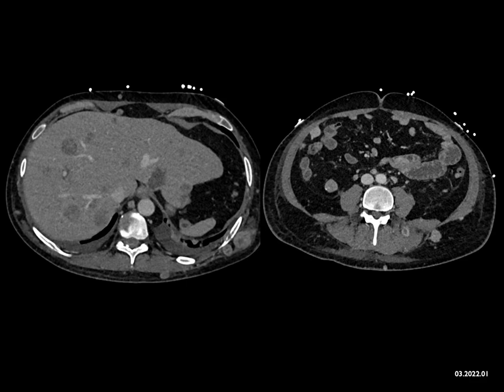The things I think about the most are lymphoma and melanoma. Neuroendocrine tumors can metastasize to multiple areas — not quite as extensive, but typically they're going to be hypervascular. Neurofibromatosis gives you skin lesions, neurofibromas in many places, but not this appearance. So we're talking about lymphoma versus melanoma.